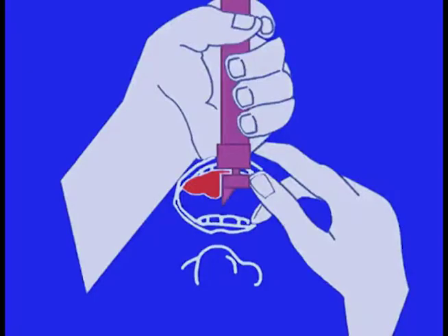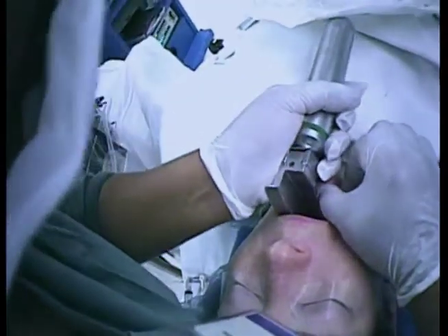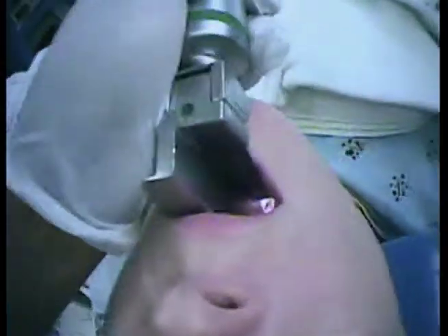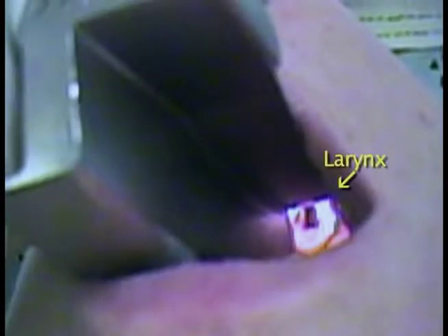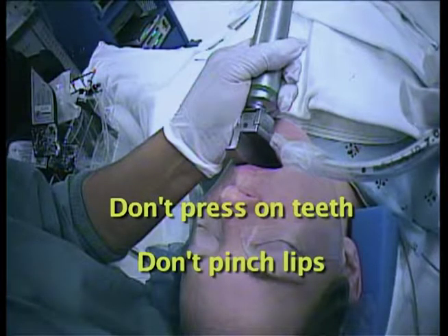As you start to slide the blade and tongue toward the left side of the mouth, slowly advance the blade until you can see the tip of the epiglottis. Lift the lower jaw upward, holding your left arm slightly bent and fairly rigid. Be careful — don't press on the teeth or pinch the lips between the blade and the teeth.